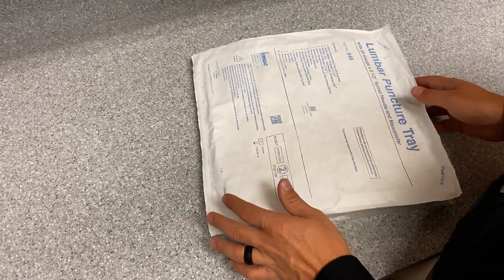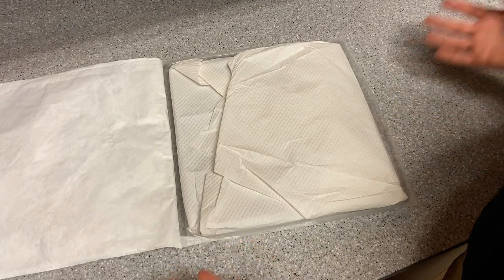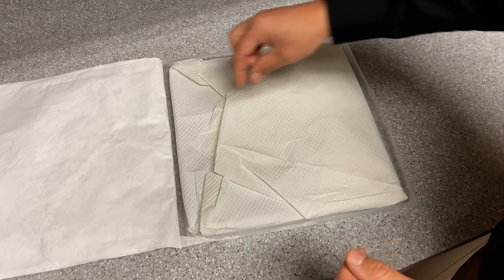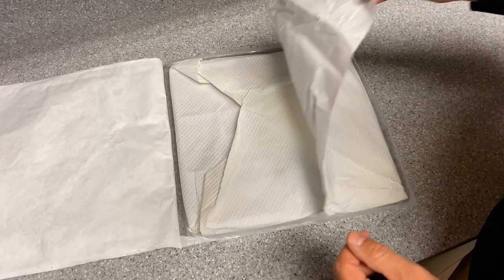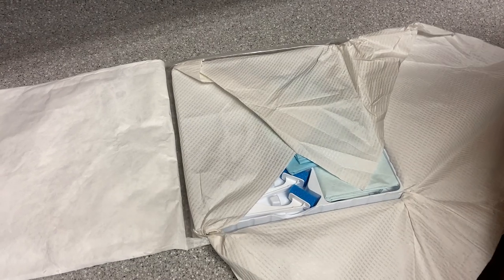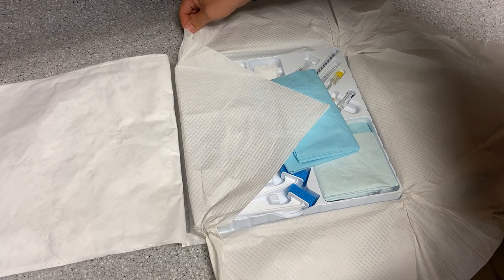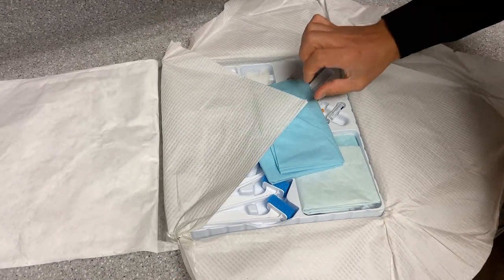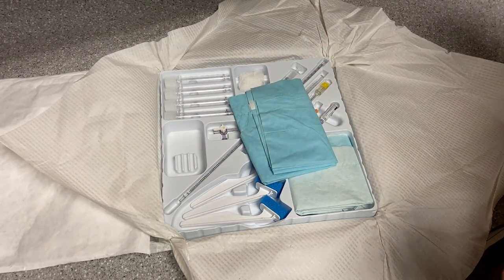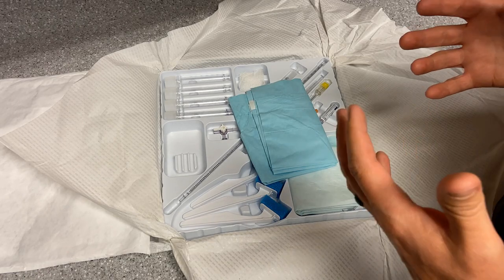Let's go ahead and open this up. You're going to open it in a sterile fashion — carefully not contaminating anything. Peel it back in an area appropriate for creating a sterile field. Open the paper wrapping in a sterile way, only touching the very edges and corners, not anything in the middle. You can use the paper to help open up the last part. Everything contained within is now sterile; don't contaminate it or touch it unless you yourself have sterile gloves on.